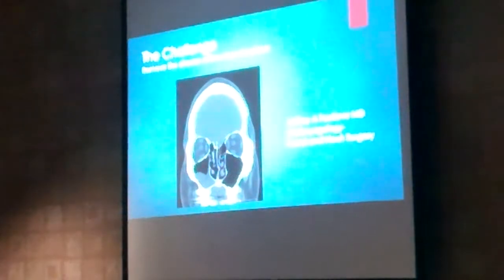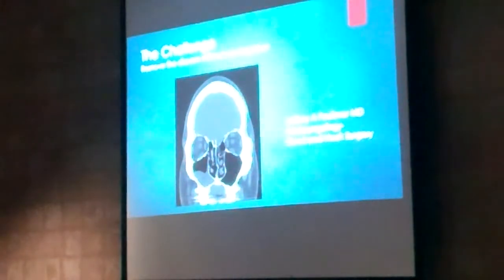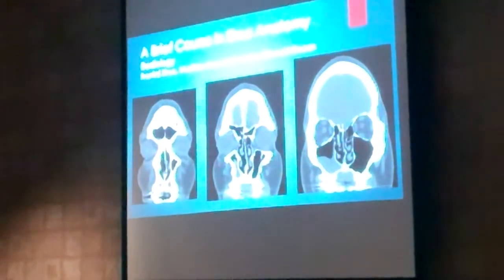know it's soft tissue, not fluid, because the fluid would have kind of a hump going down. Here are teeth, the upper teeth. You can see the teeth of this upper tooth looks like it's going up into the sinus. Most likely it's covered by a thin layer of bone that's just too small to be seen on this CT scan. Okay. Any questions on that part of the anatomy class? Okay. So here we go.